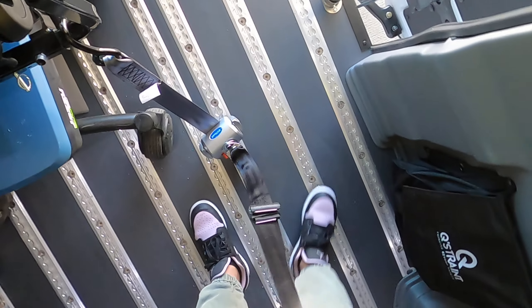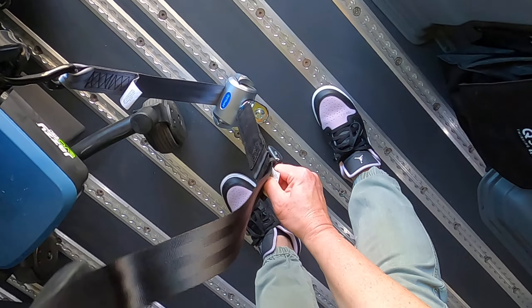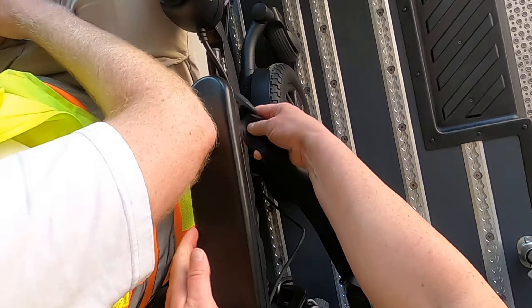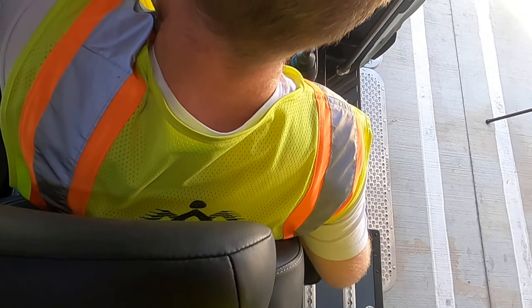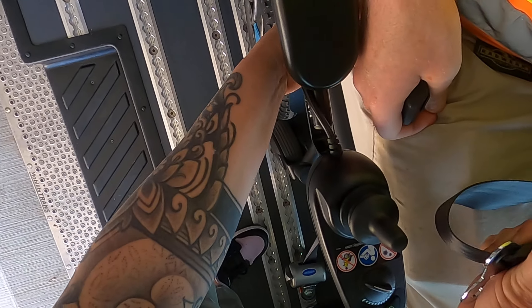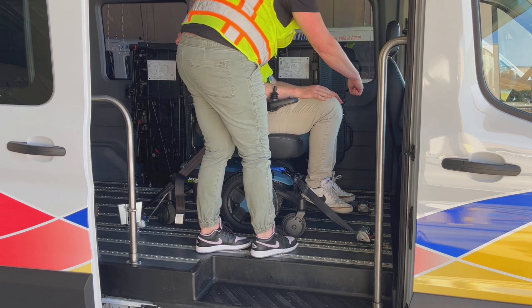Now I'm going to secure the guest using the lap and shoulder belt. First, I get the buckle side to the proper length — you want it right on the hip. For the other side, you want the belt right next to the body, not going over the arms of the chair. This chair has a gap that I can slide it down. Bring it across the guest's torso and buckle it in. If your guest can't hold it, just lay it over the arm of the chair. Make sure it's secure and not twisted. When you are done, always make sure you have four floor securements and your guest feels secure.